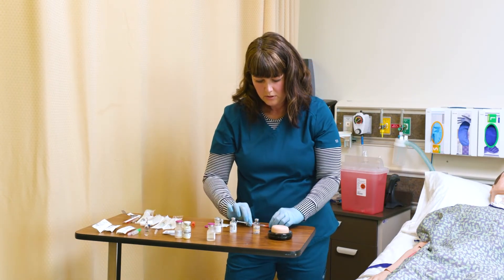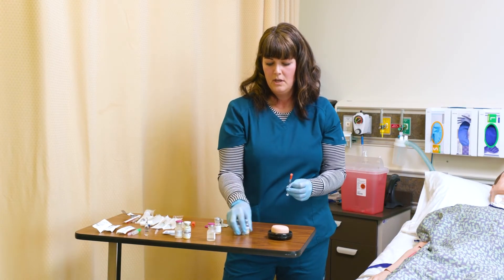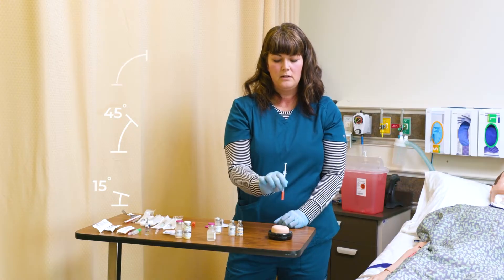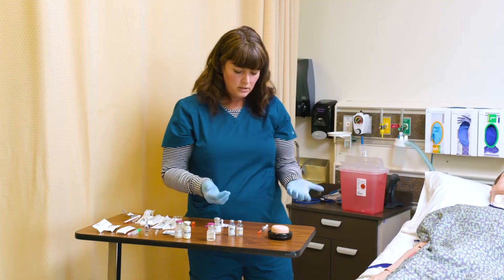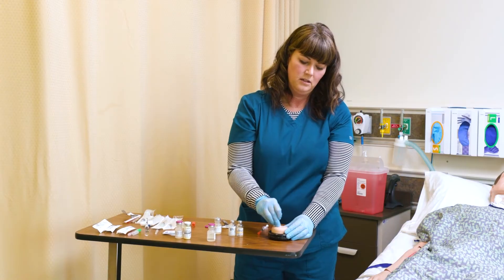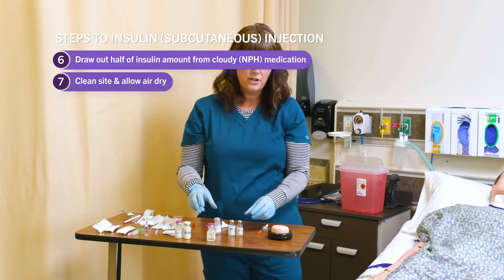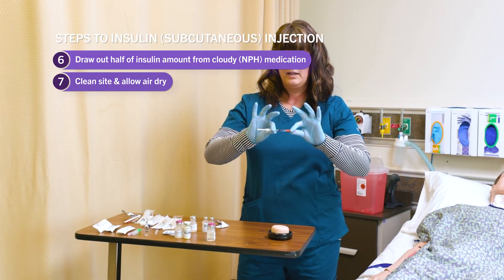One-handed scoop, recap, and go into my patient. When I give a subcutaneous injection, that means I am administering at a 45-degree angle — not 5 to 15, not 90, but 45. I'm going to wash my hands, don gloves, and clean the site using a circular motion from the inside out at the injection site, allowing that to air dry.